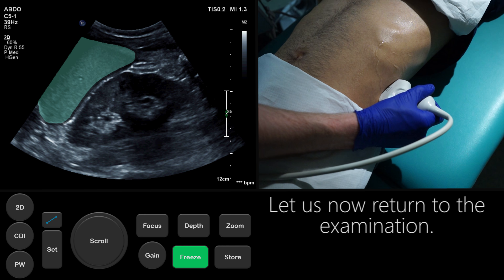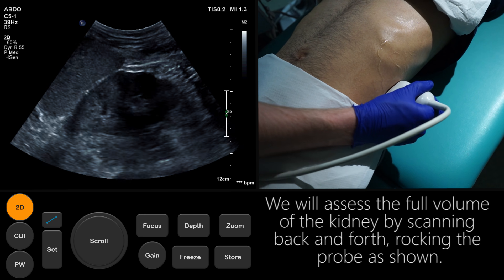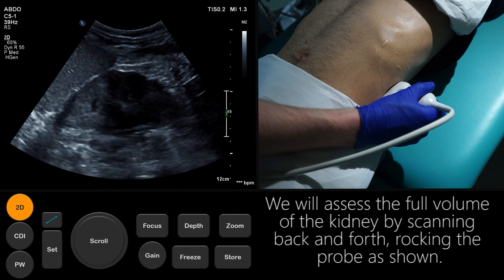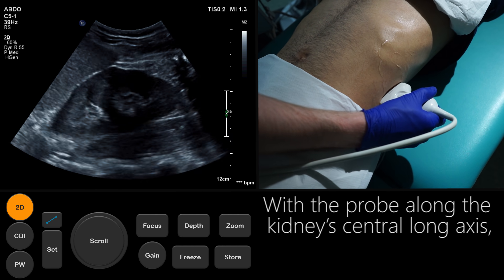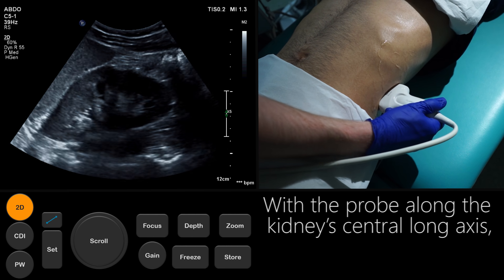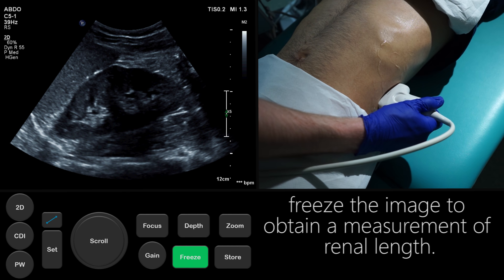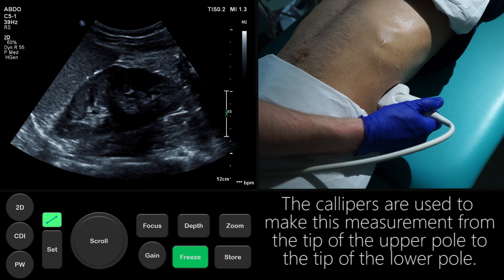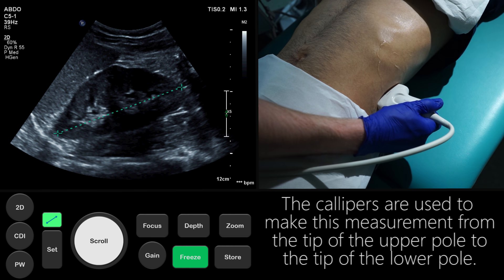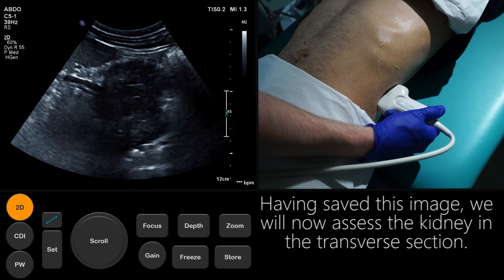Let us now return to the examination. We will assess the full volume of the kidney by scanning back and forth, rocking the probe as shown. With the probe along the kidney's central long axis, freeze the image to obtain a measurement of renal length. The calipers are used to make this measurement from the tip of the upper pole to the tip of the lower pole. Having saved this image, we will now assess the kidney in the transverse section.